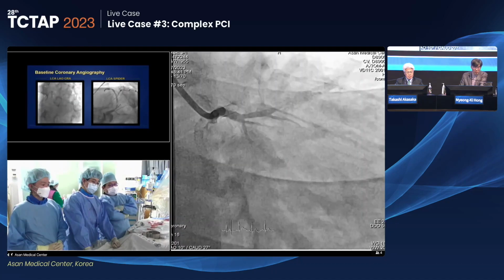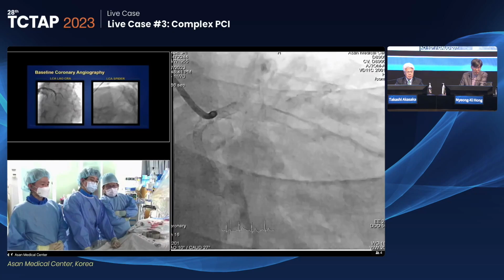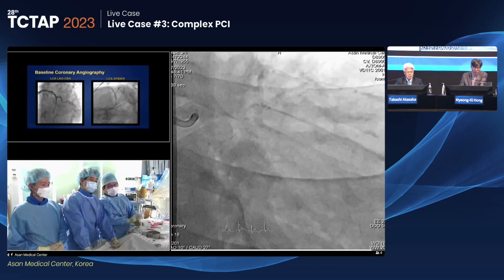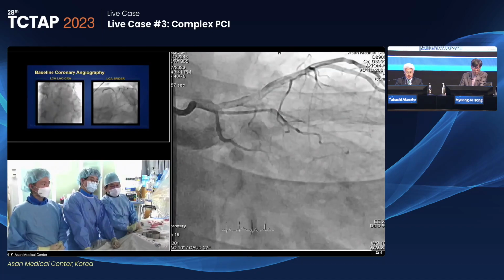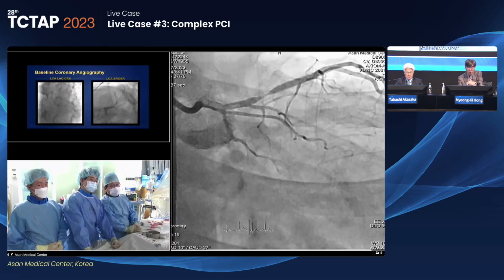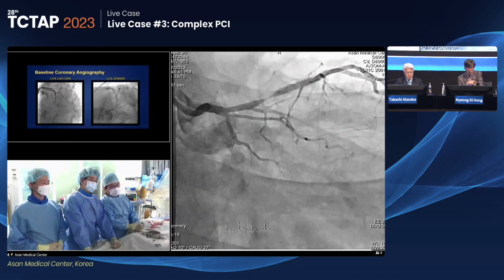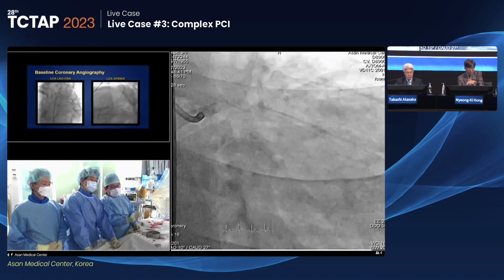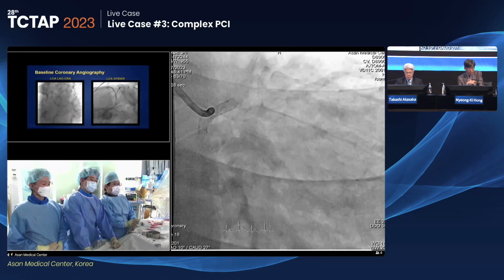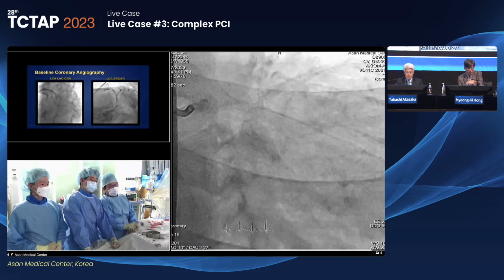The angiogram showed that it is due to the previous stent proximal portion tight in-stent restenosis. Thallium SPECT shows a large territory perfusion defect of the circumflex territory. So the circumflex territory is already total occlusion and in a stable status. So I don't like to touch the circumflex and will focus on the LAD ISR.